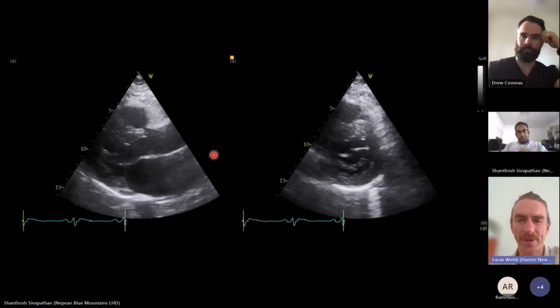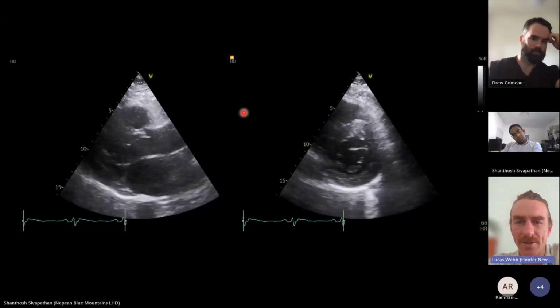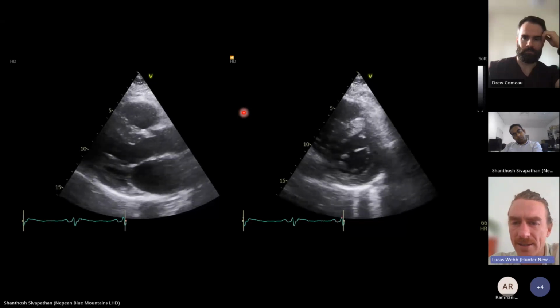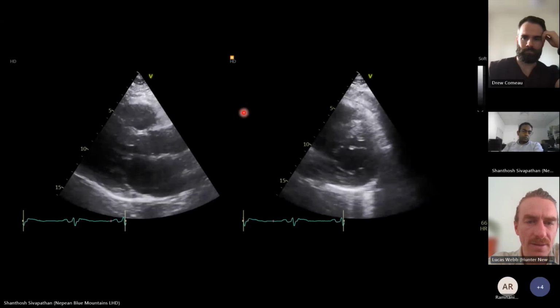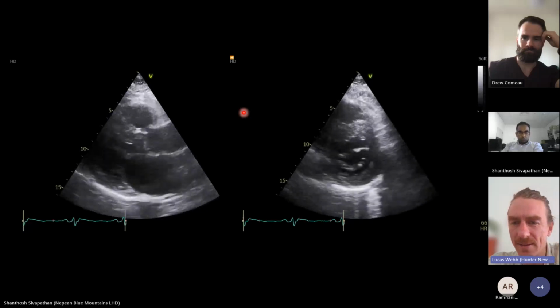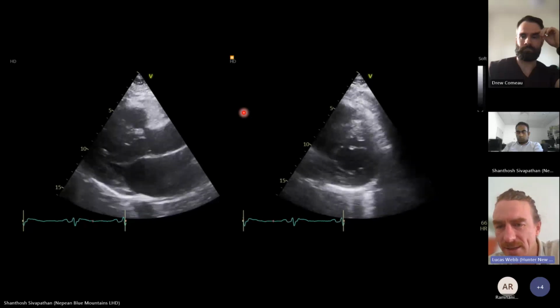Yeah, sure thing. So I think the money's probably in the anterior and anterior septal regions. They look like they're poorly contracting. Looking at the parasternal long, the RV looks like it's working well. The infraseptal wall looks like it's contracting, and in the parasternal short at the base there, I think it's the septal area largely and the anterior areas.